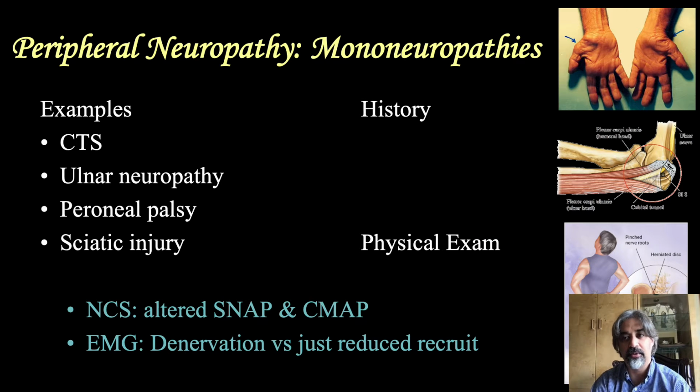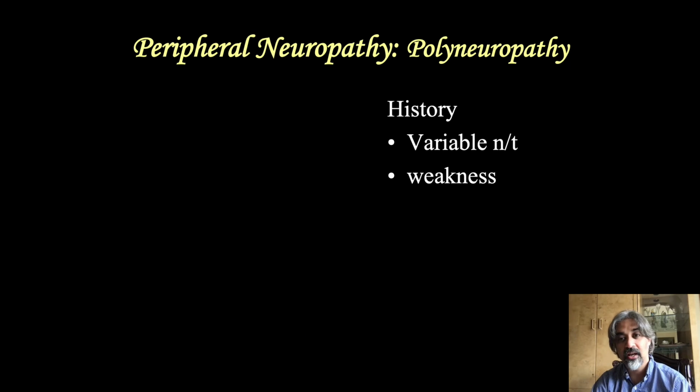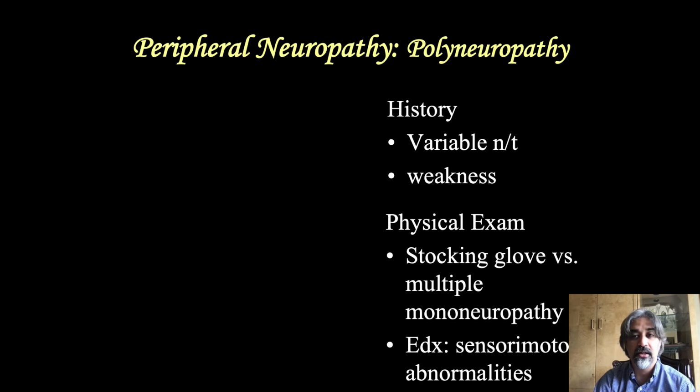Mononeuropathies are next, and they're particularly satisfying to diagnose and treat, as we use clinical, electrodiagnostic, and now ultrasound modalities to accurately expedite treatment. When we're faced with more than one nerve, peripheral polyneuropathies can be clinically and electrodiagnostically characterized by their pattern of presentation.